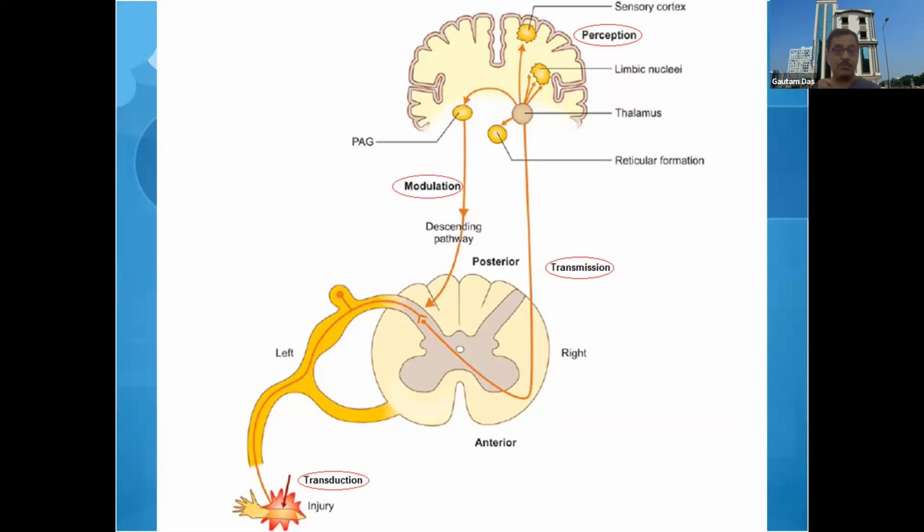But nowadays, laminectomy is very rarely done. Mostly it is done by us, pain physicians, putting in a special kind of epidural needle, through which we put the electrodes into the epidural space. So what is the mechanism of action here? This IPG creates the electrical signal, which specifically stimulates the larger diameter touch fibers.